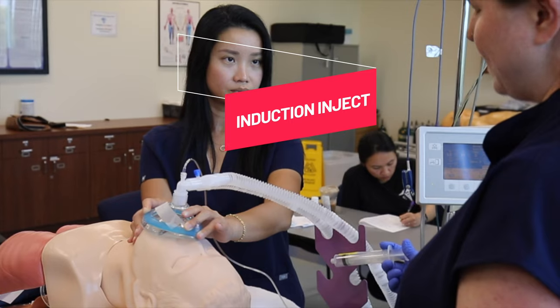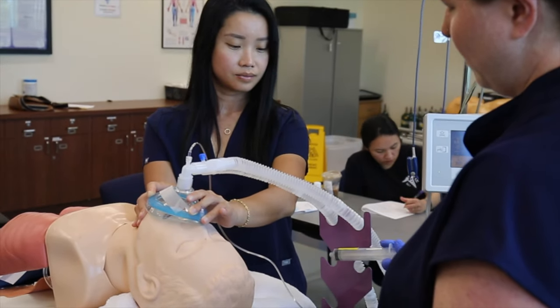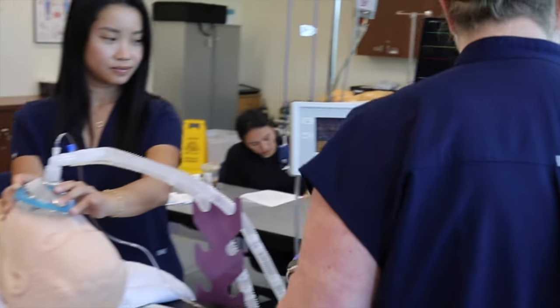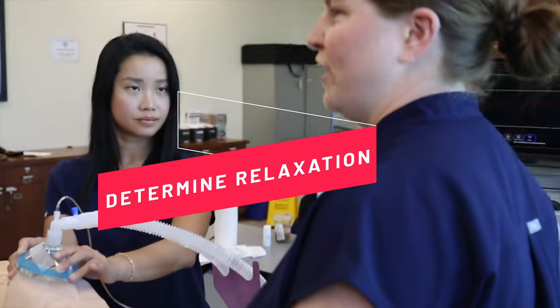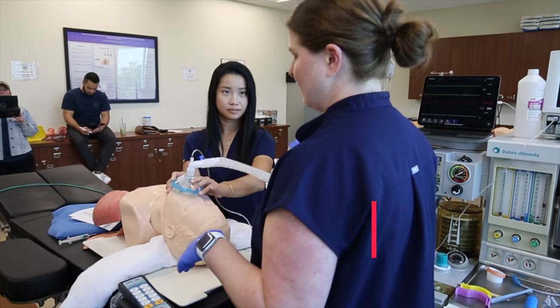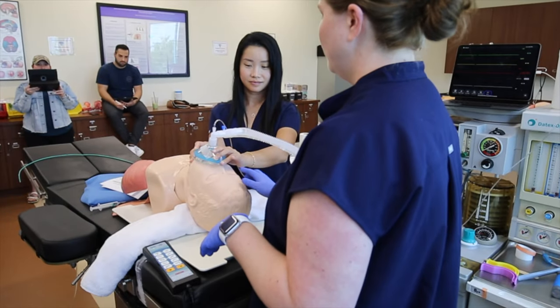You might feel a little spicy in the IV. That's totally normal. This is a medicine that helps you go to sleep. It'll take great care of you. All right, and then you're going to see the face start to relax. You're going to see your end tidal CO2 line fade away. And you're going to say, hey, are you still awake? Are you with me? No.